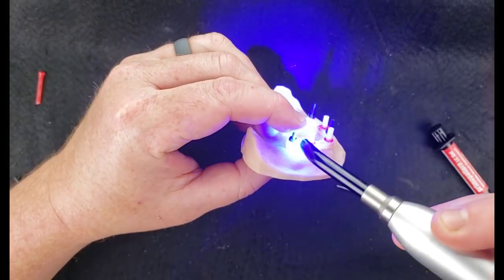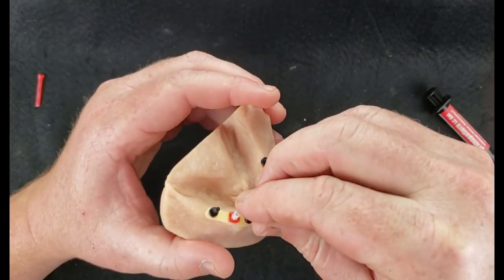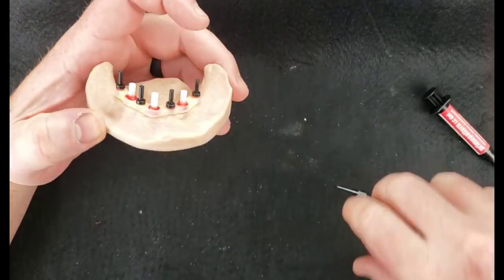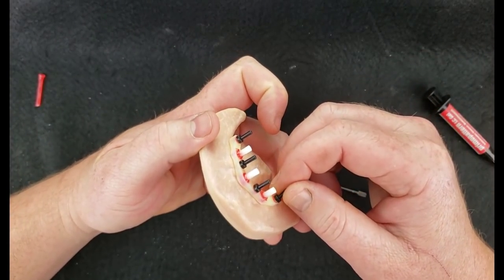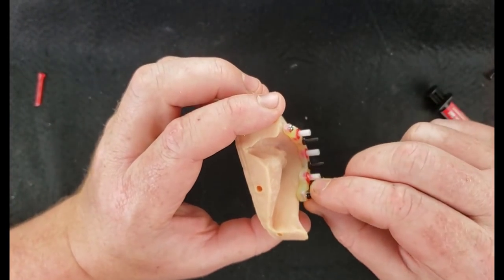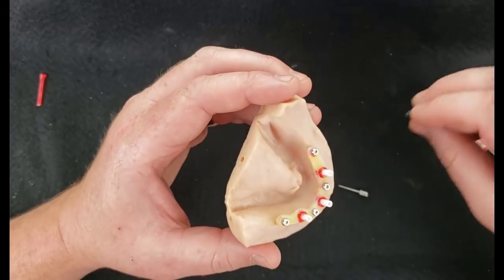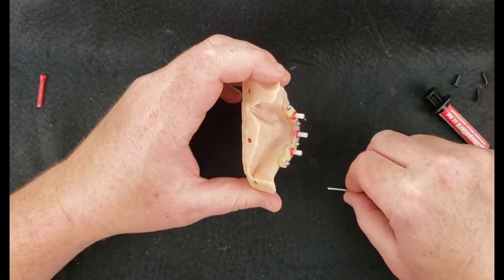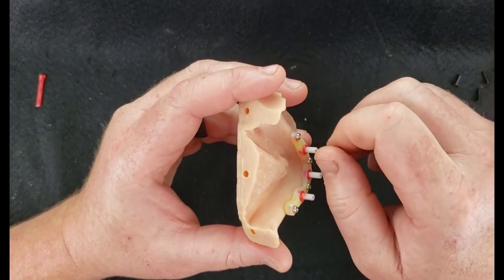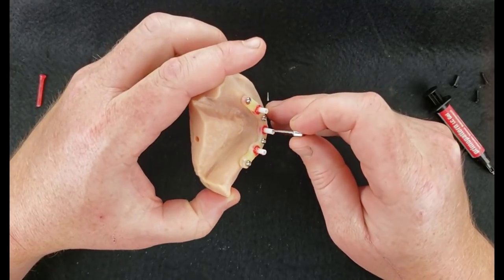Alright, and just making sure that I'm holding everything in parallel. Okay, and this is our completed bar. You can see here, if I was to peel that off, that the locators are now embedded into this bar. And all that I need to do now is unscrew this and look on the underside and any little gaps that may have been left. Let's set these screws aside here as well.